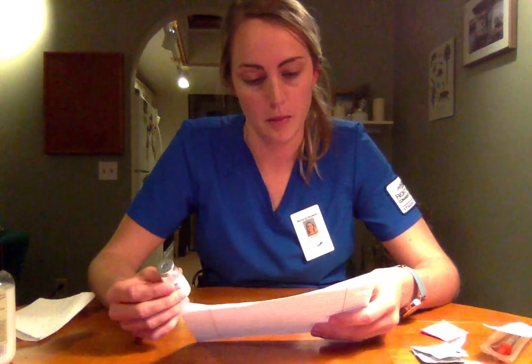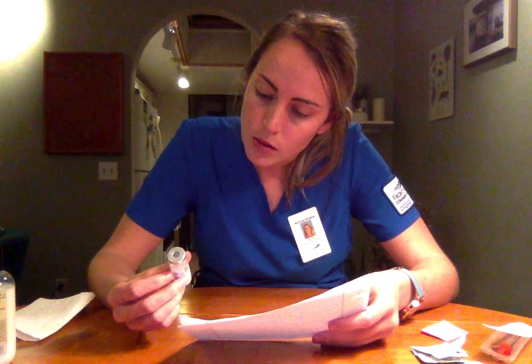So comparing my vial here and my MAR, I have the correct patient name, Abby Abdomen. I have the correct drug here, so NPH insulin, and the strength is 100 units per milliliter. I'm going to be administering 26 units, and the route is subcutaneously. The time is stat, so as soon as possible, and I will document later.